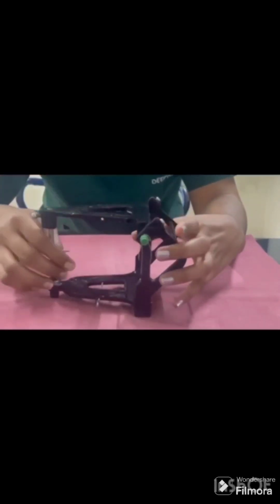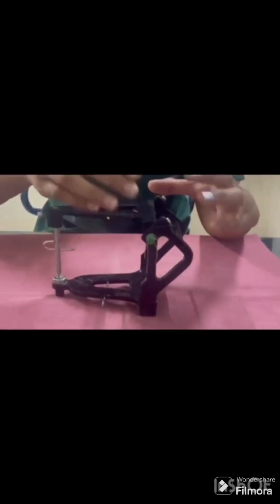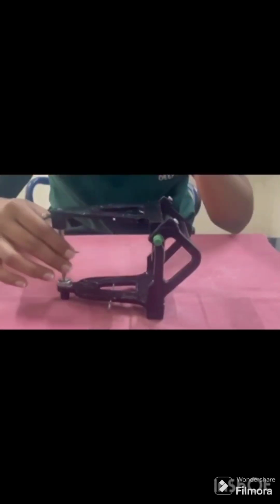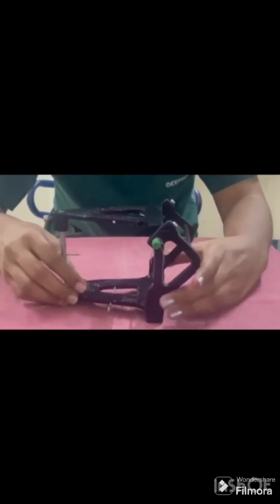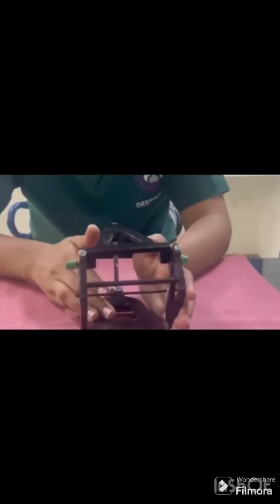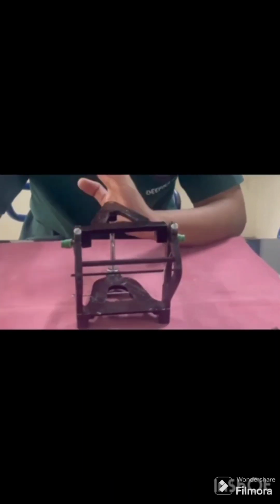What are the functions of articulators? It is used to hold the maxillary and mandibular casts in a planned relation. It is used to simulate the patient's TMJ, maxillary and mandibular movements, to open and close similar to the patient, to study the occlusion and the mandibular movements, to arrange the artificial teeth and to mount the cast for diagnosis, treatment planning and patient presentation.